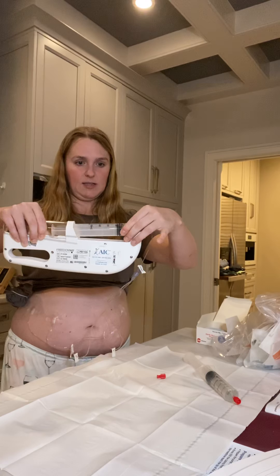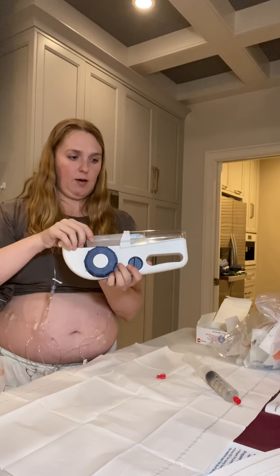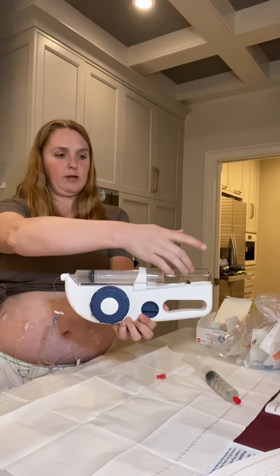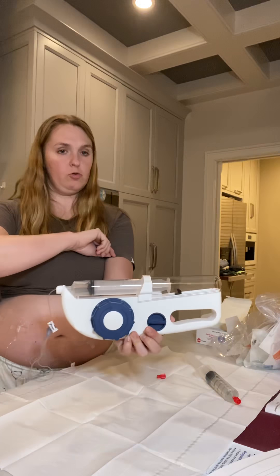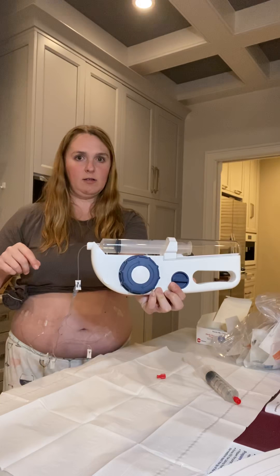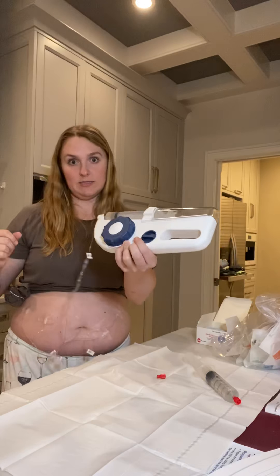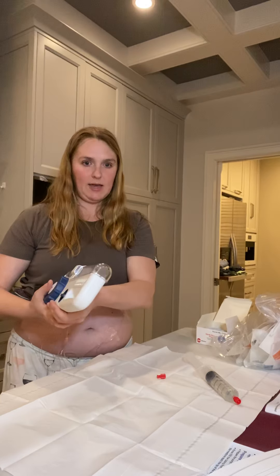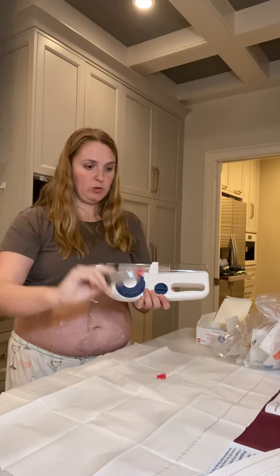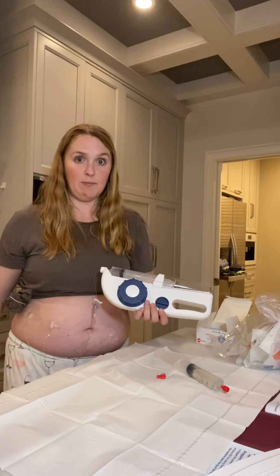I stick the syringe into this gizmo, which is my pump, and turn it on. It automatically brings a little pressure piece up to the back of the syringe and now it's going to start putting the gel in. I'll feel a little pinch — and there it is. The infusion is happening. When this first syringe finishes I'll switch to the second one, then just pull the needles out, throw everything in the sharps jar, cover my stomach, and I'm done.